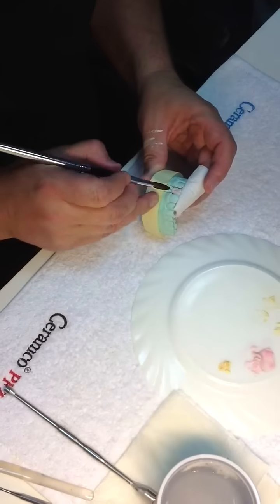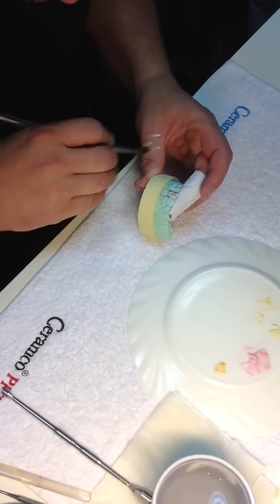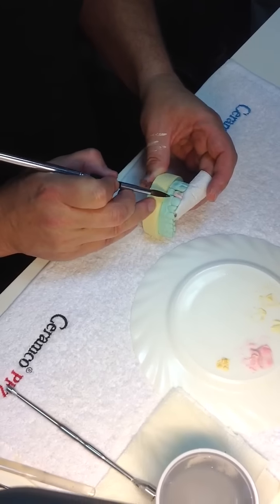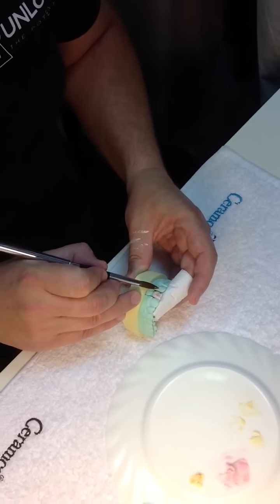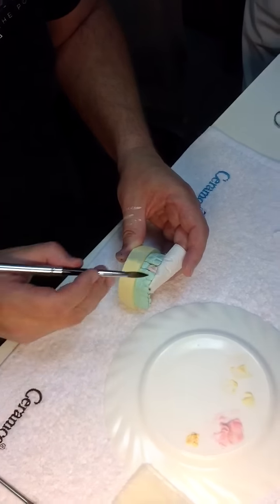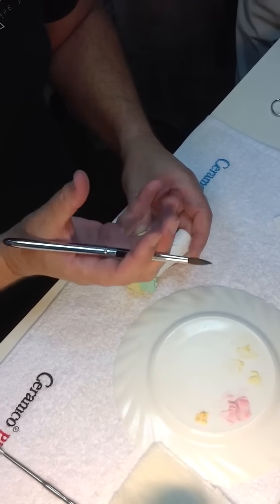Now we start from the mesial. Just get the mesial line. I always start from the mesial part to draw this line. There's no separator. I don't use any separator on the adjacent teeth. Just using the stone. See how the stone is absorbing the moisture from the porcelain? Just helps to keep the porcelain in place.